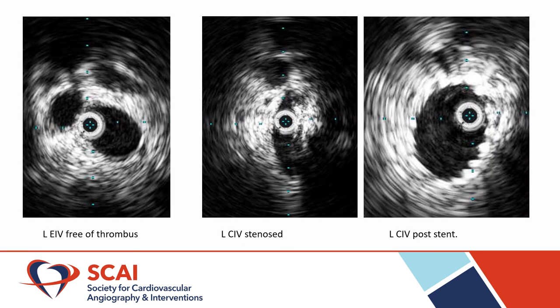Here are some representative intravascular ultrasound images from the second procedure. On the left, you can appreciate that the left external iliac vein is now free of thrombus. The left common iliac vein in the center image is compressed and stenosed, and post-stenting there is a significant luminal area gain.